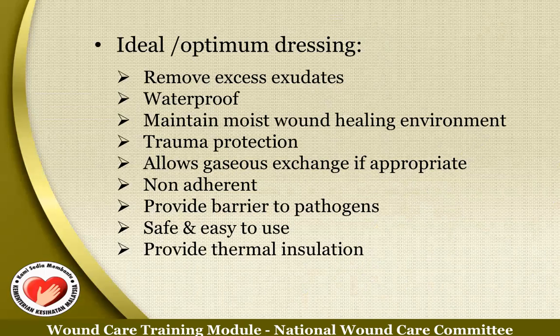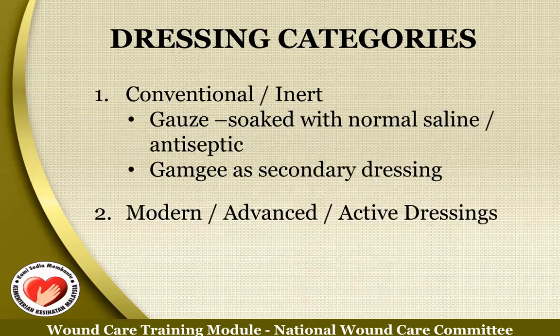The ideal and also optimal dressing must have the criteria below. First of all, remove excessive exudate, have to be waterproof, maintain moist wound healing environment, trauma protection, allow gaseous exchange if appropriate, non-adherent, provide barrier to pathogen, safe and easy to use, provide thermal insulation.